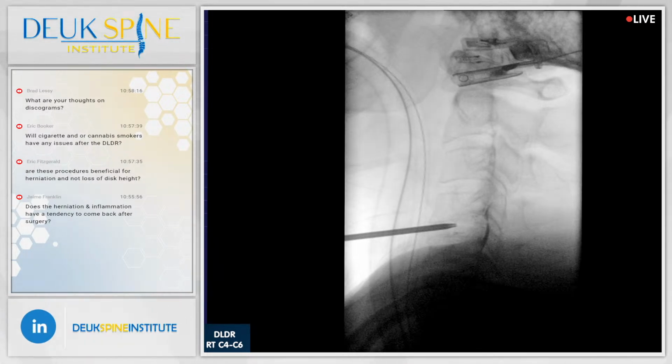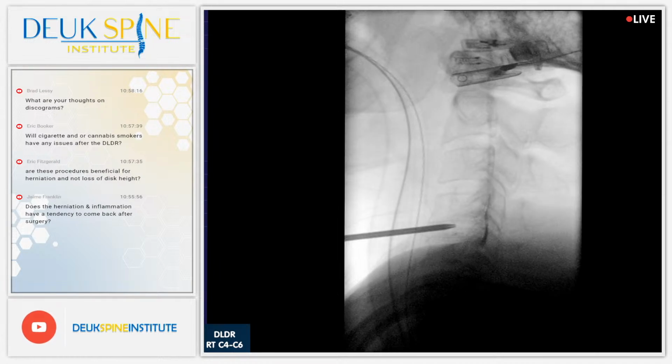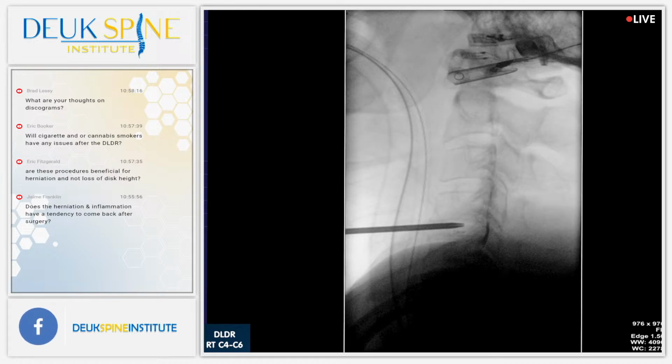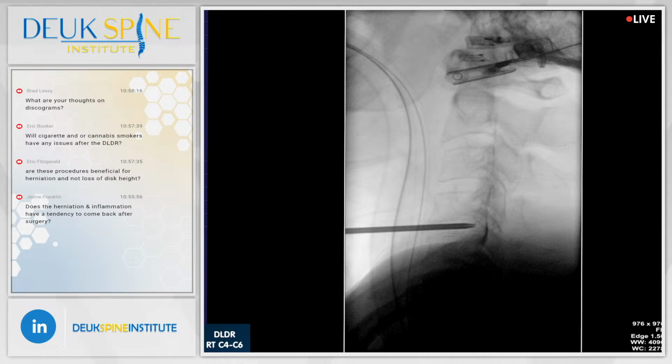Shot. All right, we got some out. Look at that. So what this tells me, based on what I'm seeing there on the X-ray, is the dye has leaked out through a very small, difficult to see tear, and I can feel resistance in the disc to this dilator. Shot. And I can tell you right now, the reason I'm feeling it, shot, and the reason we're not seeing a bigger tear is there's a lot of scar tissue here. It is not normal, which tells me this disc is probably the one that's been injured the longest.